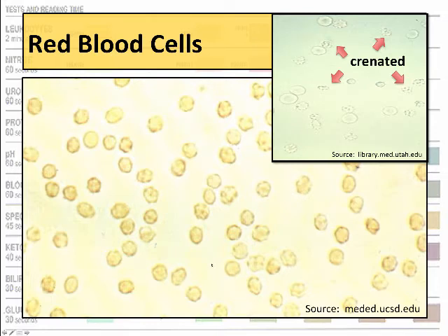There could be trauma to the kidney if you had gotten hit there or fell onto it or something of that nature in a car accident. That's another reason you might see it. There are normal reasons or logical explanations for it too. It doesn't always have to be something terrible. After exercise, sometimes this happens, very strenuous exercise, and obviously women who are menstruating, when they're collecting their specimen, contaminate it, you will see blood in the urine as well, red blood cells. So things to think about as you're identifying them. Something very common, potentially you might see it as you do your own examination.